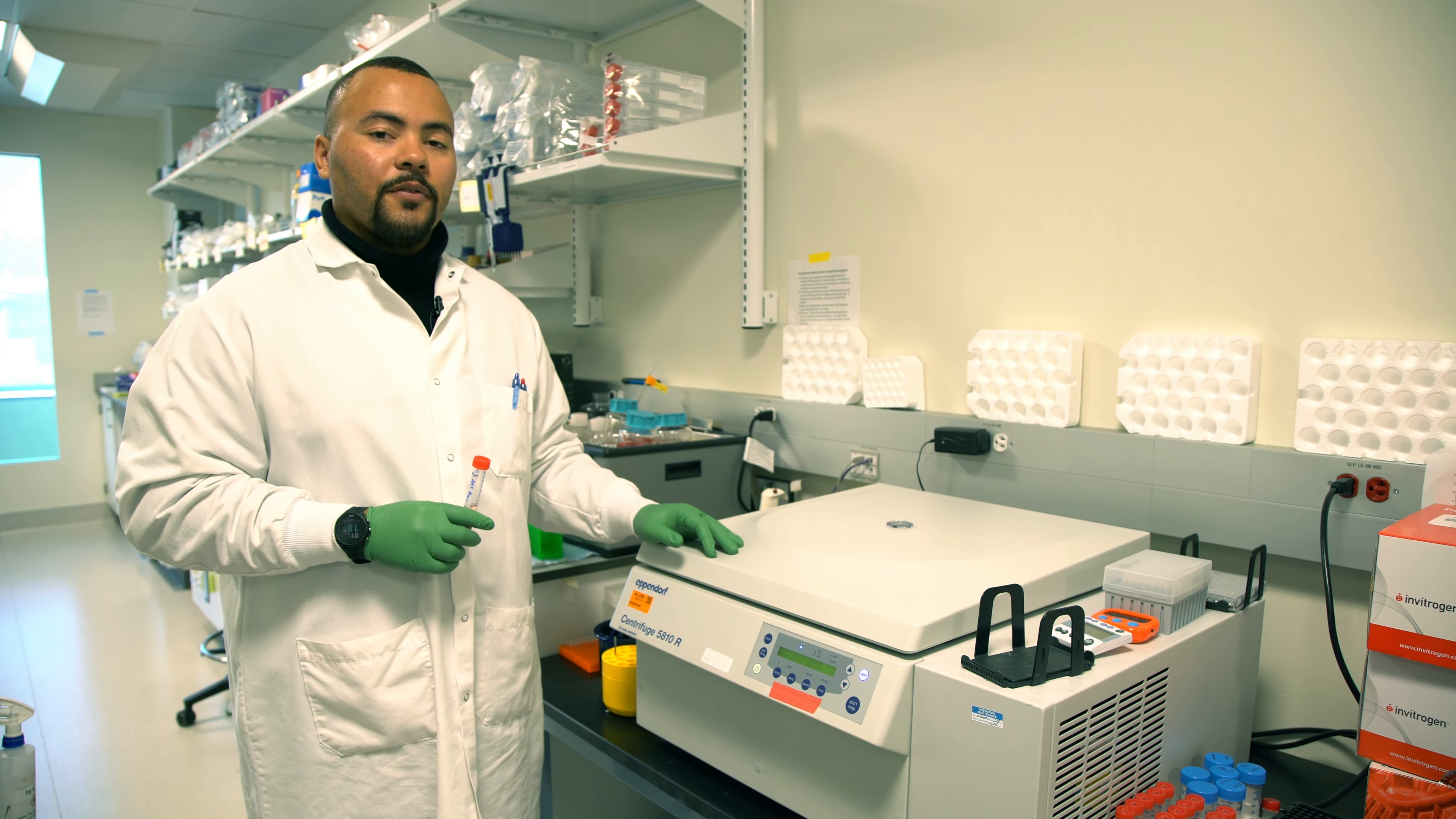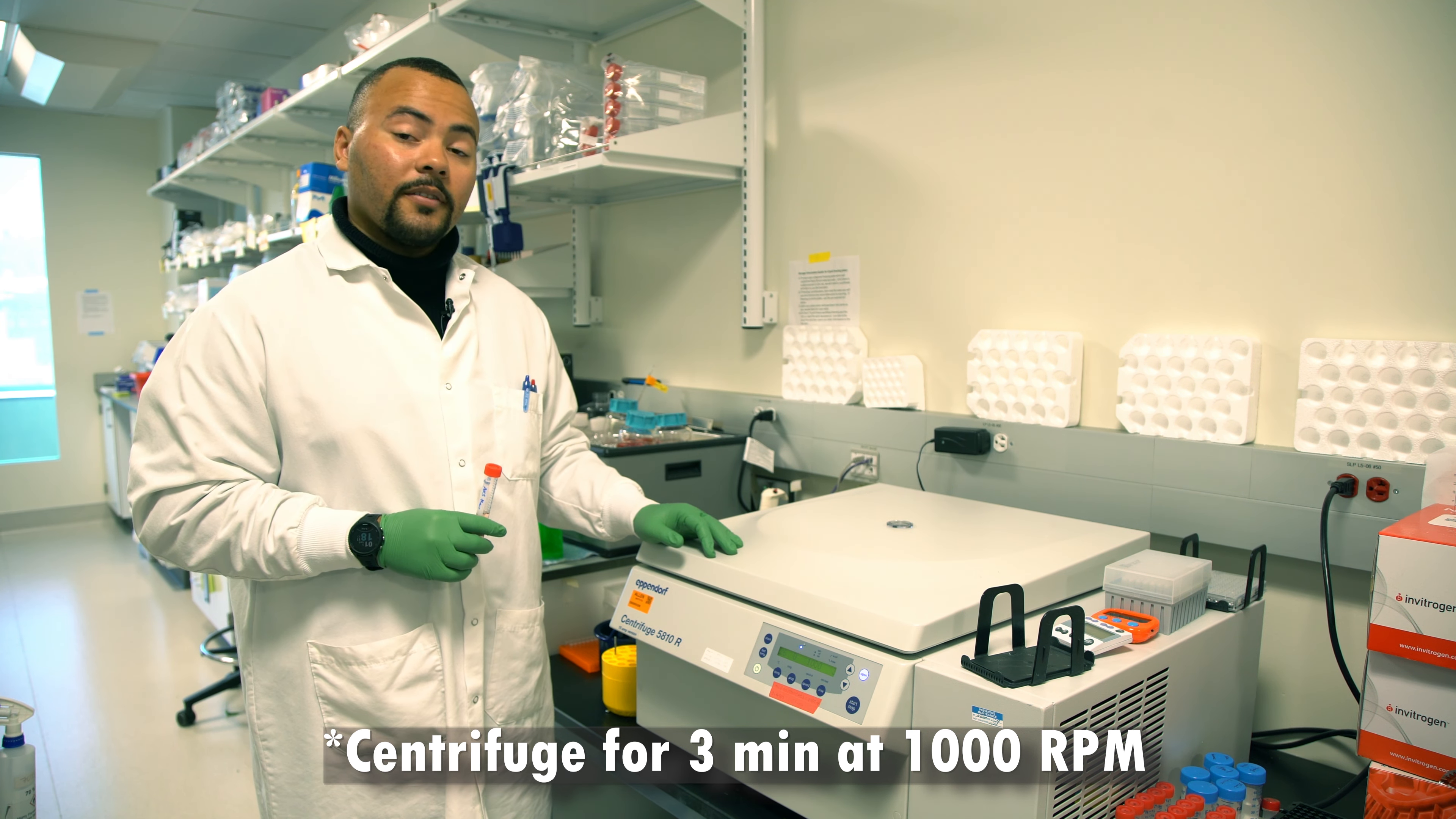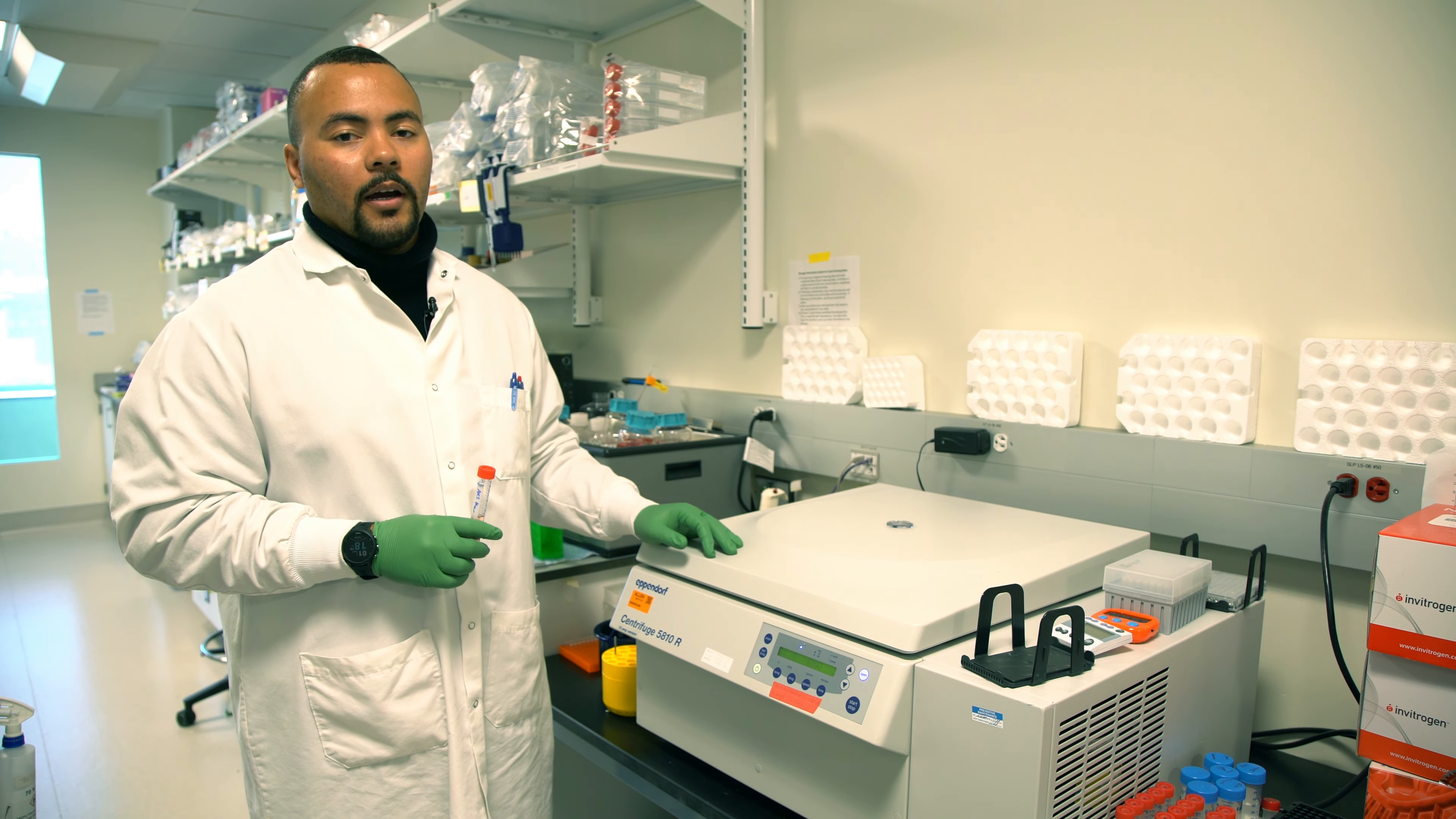Our next step is to centrifuge our cells at 1000 RPM for 3 minutes at room temperature. This step will help concentrate our cells at the bottom of the tube before we move them to our recovery plate.